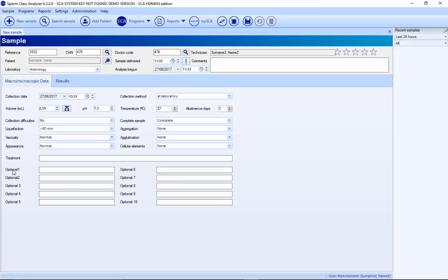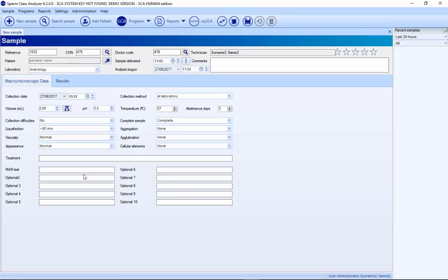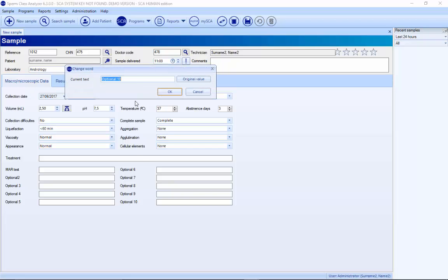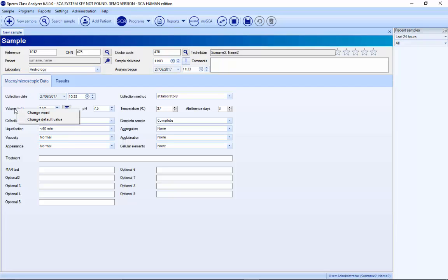It's also possible to customize the optional fields by right-clicking or double-clicking. If one of these optional fields you don't want to appear in the report, just double-click, remove the word, and it will disappear from the report and from everywhere. All these fields are possible to modify by right-clicking. It's also possible to modify the volume and change the default value.